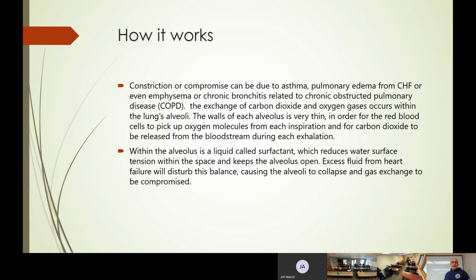Okay. All right, so how the CPAP works, right? The constriction or compromise can be due to asthma, pulmonary edema, CHF, or even emphysema, chronic obstructive pulmonary disease. The exchange of carbon dioxide is restricted in the lower levels of the alveoli.